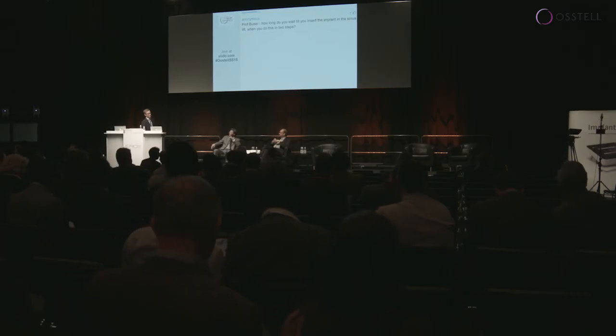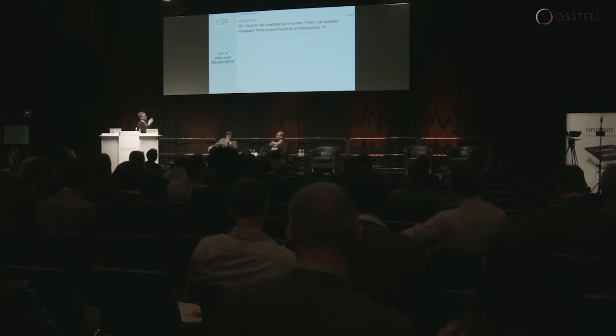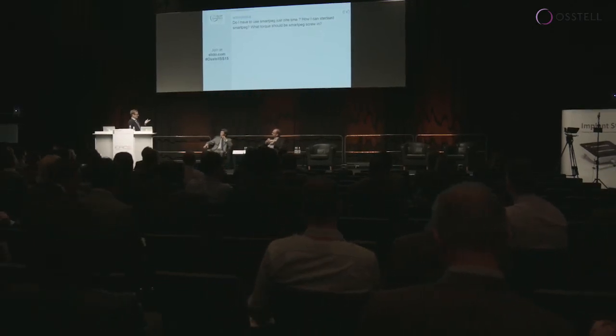Okay. I also saw in your lecture, Professor Buser, when you measure the ISQ during the surgery, we discussed this, me and Peter, and there's a question touching slightly upon that, about the SmartPeg that you're using, if you can use it only once, and you also talked about changing gloves. Yes, because I want to take the measurement myself, to have really nice orientation. So I take a new glove and then attach this non-sterile handle, measure it, and then take the glove off again, and then take the SmartPeg off.